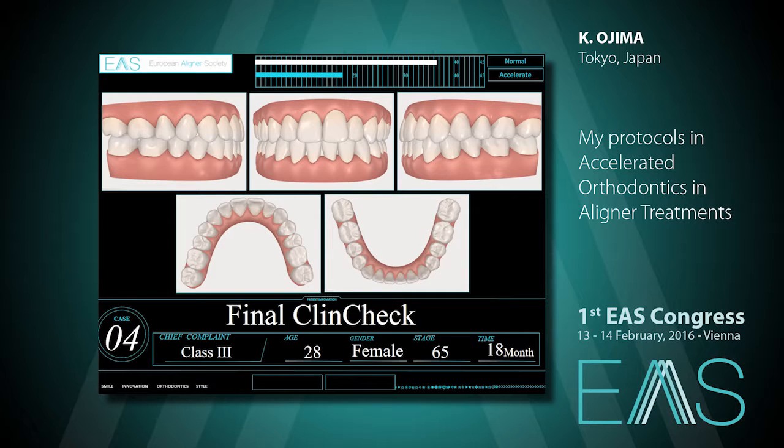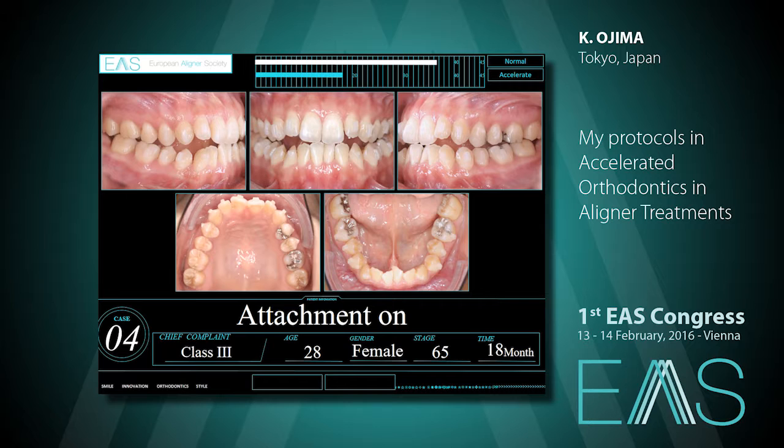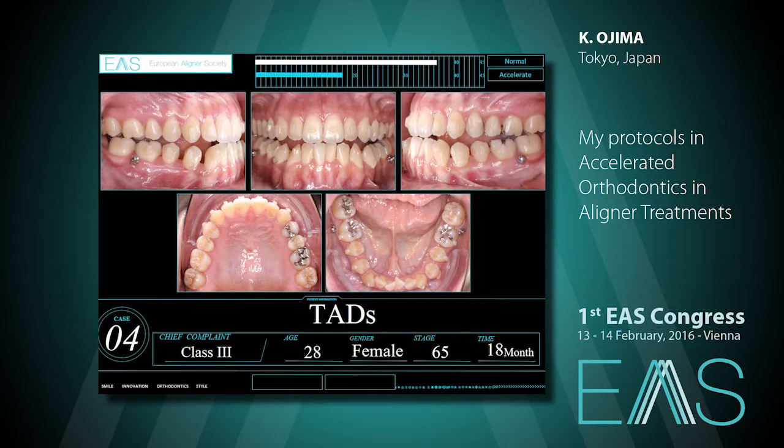This patient, the 37 and the 47, need 4.0 millimeters of distalization. The first molar is the same, the premolar is the same. The attachments were placed, and 1 month later the lower molar distalization started. As you can see, there is space between the first and the second molars.